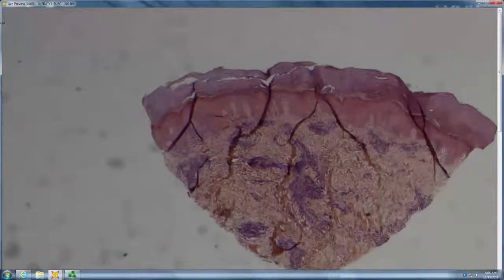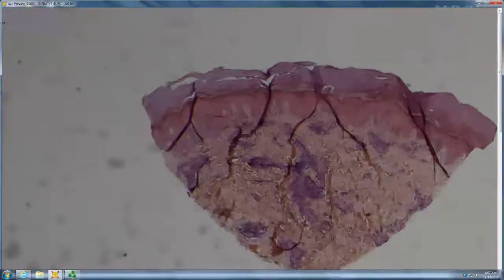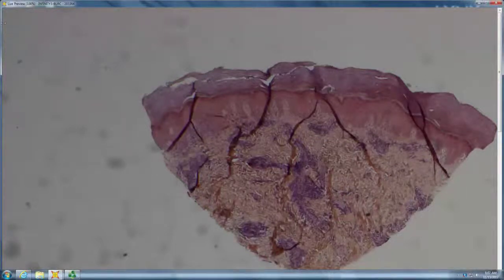Okay, so this whole pile is things in the wrong box from whoever was reviewing slides and had them out on the table. Okay, slide's a little pale. But what's your pattern? A whole lot of papillary edema, so just depending on the infiltrate underneath. If we go down to Sweet's or lymphocytic type patterns. If it's lymphocytic pattern, you might think of PMLE, that looks like maybe even acral skin, right? So Sweet's, or the other thing on acral skin, pustular dermatosis of the hands, those would all be your differential. But it's one of those infiltrates with big papillary dermal edema.